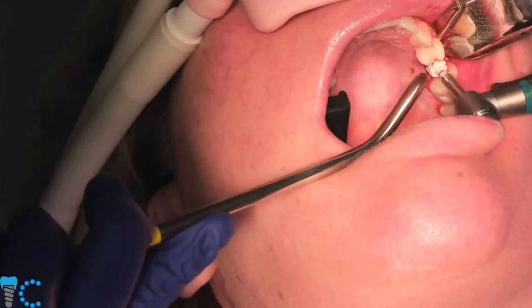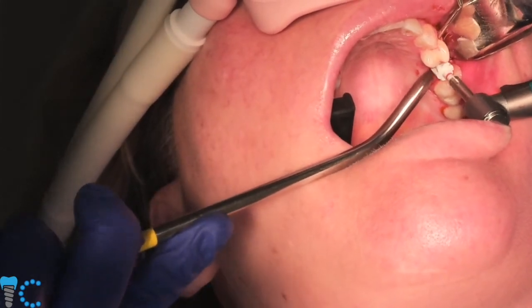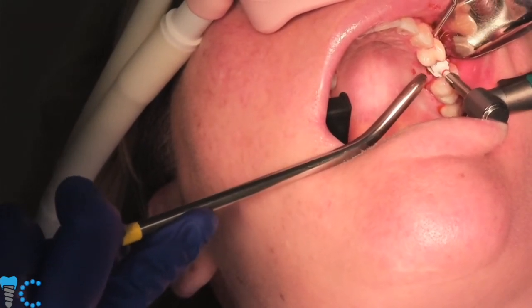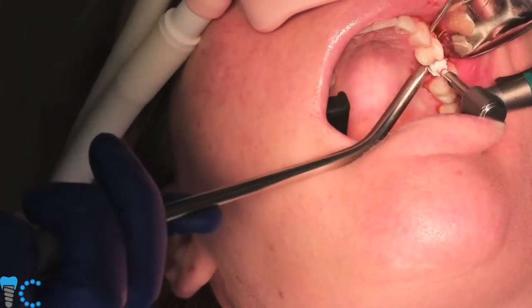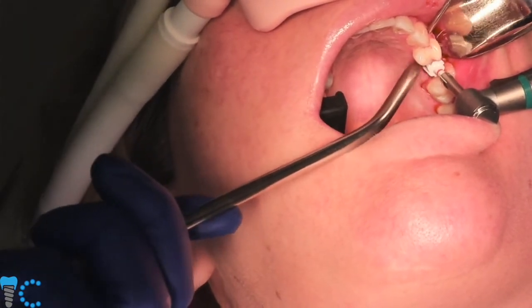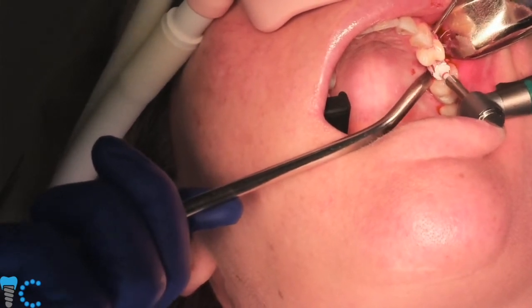So we have kind of a tight fit here for our countersink. We've gone through our 3 twist drills. We're using our countersink drill. And the good thing about a tight space here, you can probably see I'm right up against both teeth with this countersink, which means that our implant osteotomy is smack right in the center. I mean, we could not have it more in the center. We're literally touching both teeth.